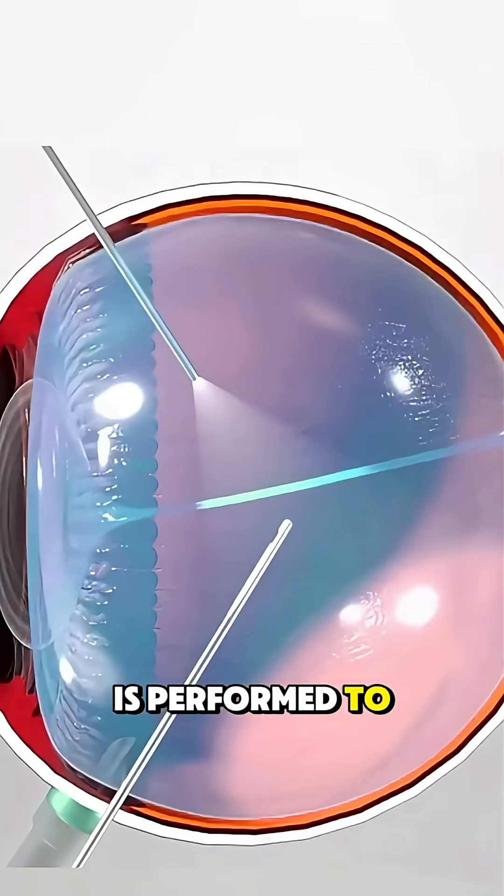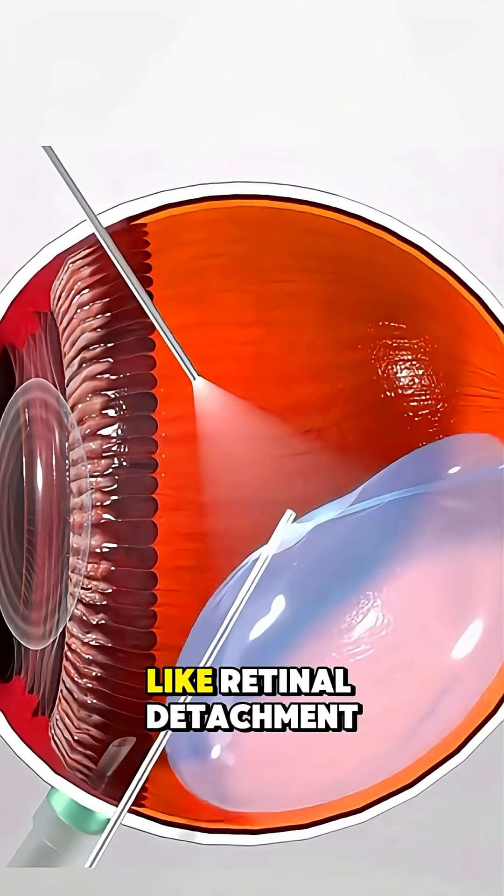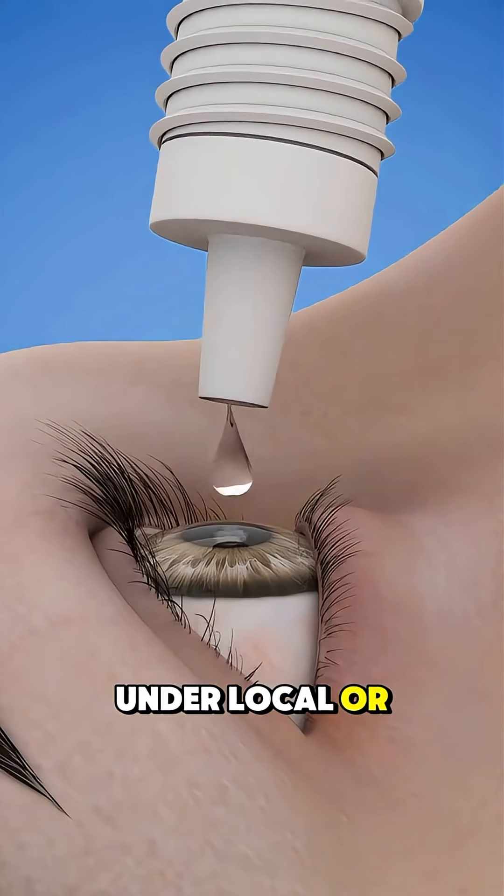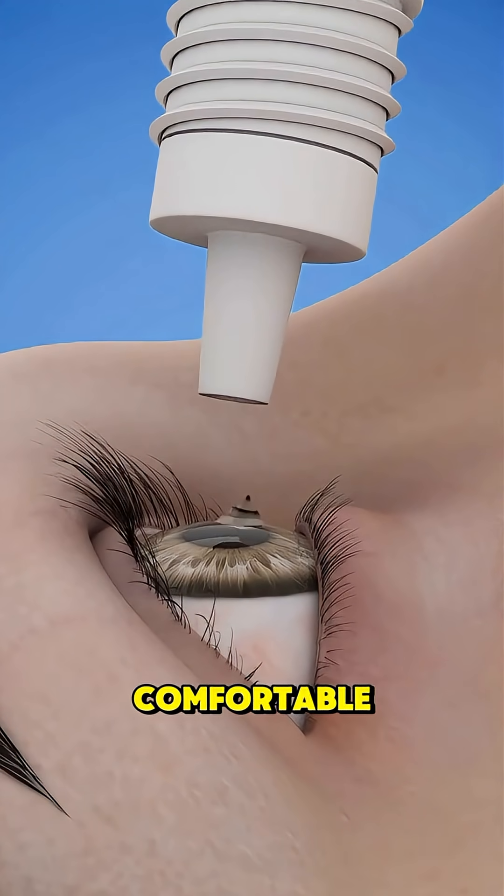Vitrectomy surgery is performed to treat problems inside the eye, like retinal detachment. The procedure starts under local or general anesthesia to keep you comfortable.